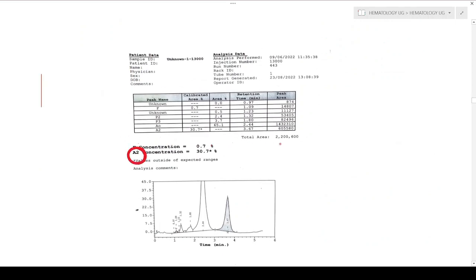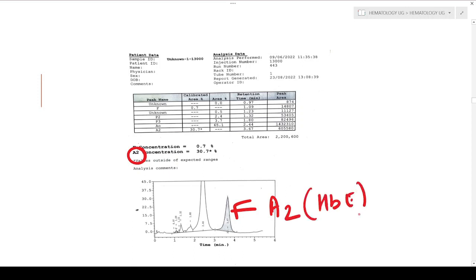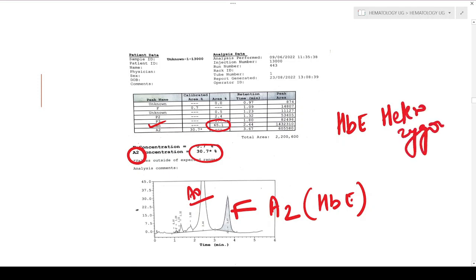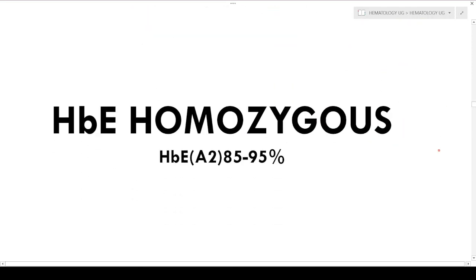This is another chart where the A2 concentration mean value is approximately 30%. This is not actually A2 — it is HbE eluting at the A2 position. When levels are approximately in this range and A0 is also normal at approximately 60 to 65%, this is mainly HbE heterozygous.